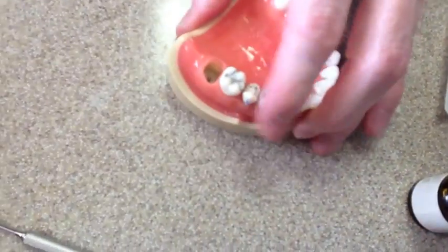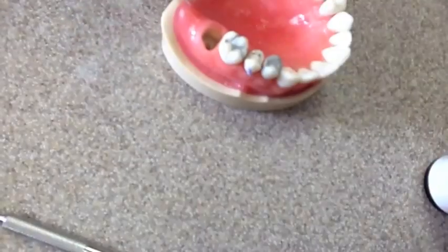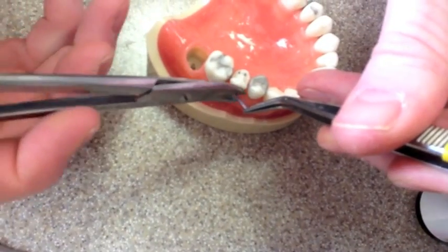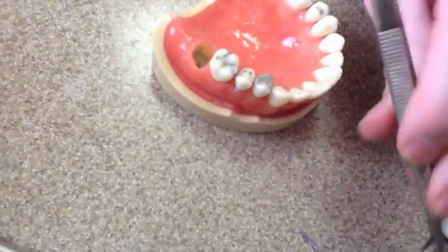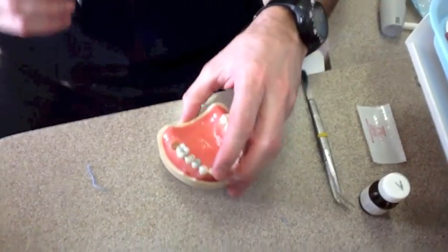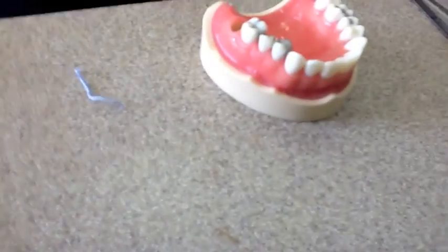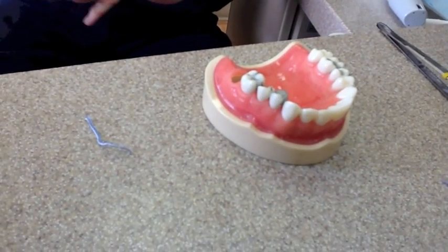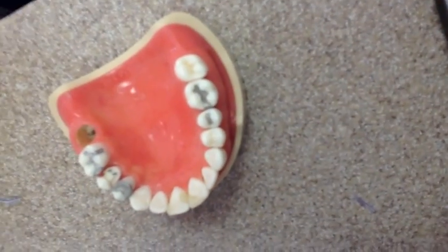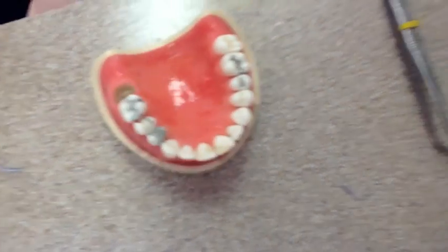So I'm going to take the scissors, and on the purple one, I'm going to pull that tight, and I'm going to trim right off where I started, and then we take the purple cord and finish it all the way in. So when you're done with the purple cord, go ahead and look around that. You cannot find the purple cord. It should go completely buried underneath everywhere.